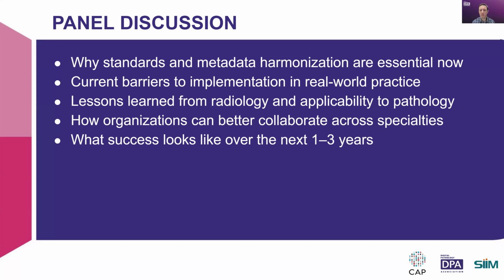And it also outputs the report of the data and of what would go to a record system. Those reports are often PDF style reports, and they're wrapped in DICOM. So they're DICOM compliant, but they don't have the raw images that are sent to an archive.